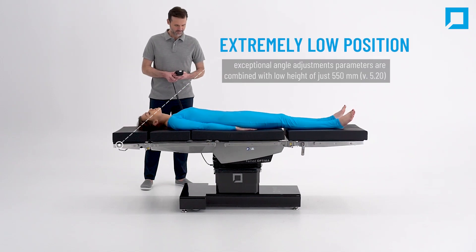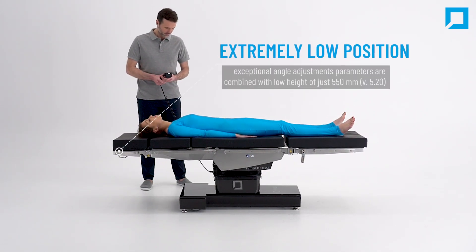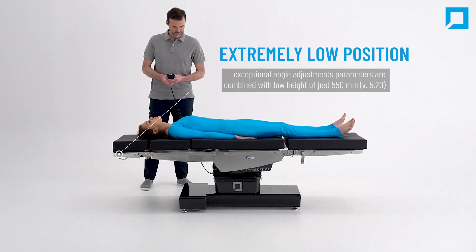It is one of the lowest operating tables in the world. An ultra-low height of just 550 millimeters is combined with exceptional angle adjustments.